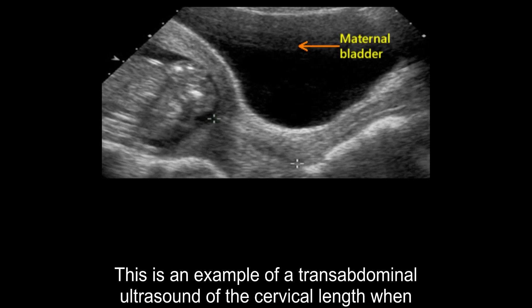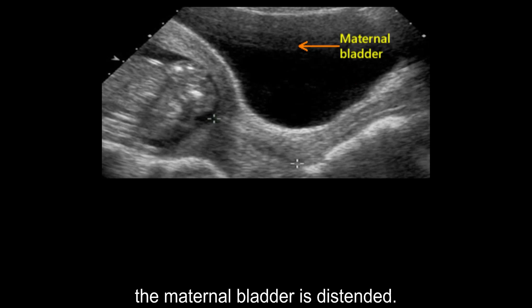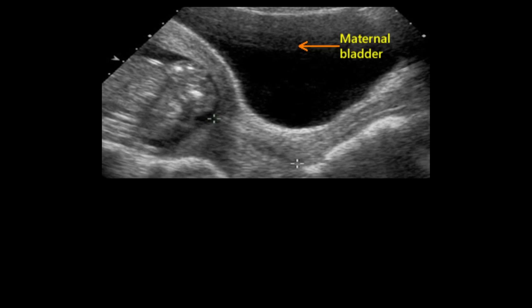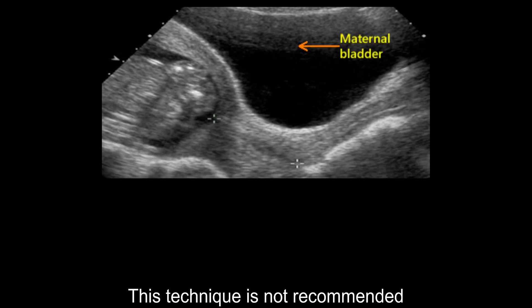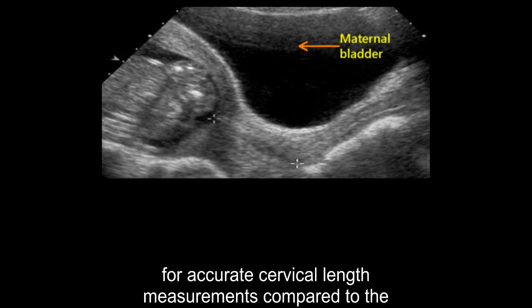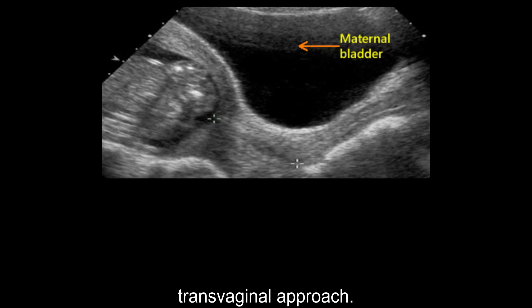This is an example of a transabdominal ultrasound of the cervical length when the maternal bladder is distended. This technique is not recommended for accurate cervical length measurements compared to the transvaginal approach.